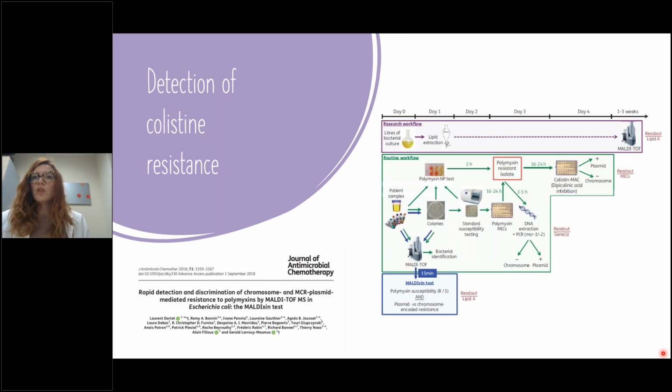This other approach is the detection of colistin resistance, and it is very interesting because the research workflow may take days to perform the lipid extraction, as it is based on measuring lipid A in bacteria and seeing if this lipid is modified or not.